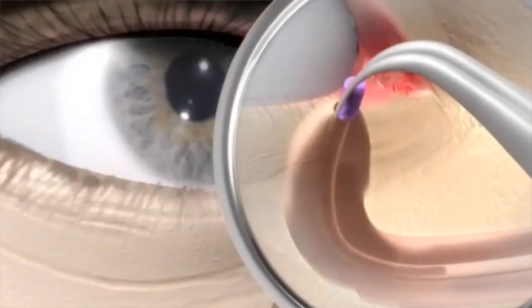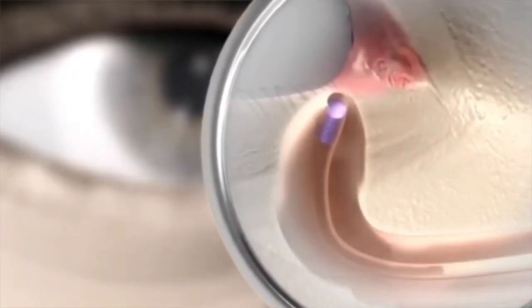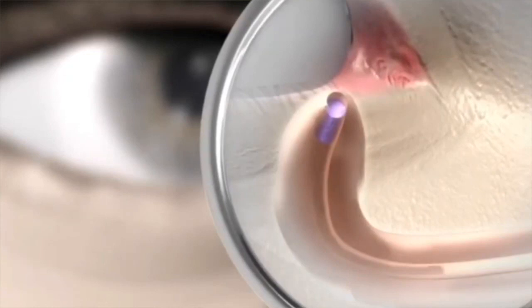In addition, during the surgery or after the surgery, we can place small tear drain blockers in the area where tears drain from the eye. They're called punctal plugs. By placing those there, they last about 3 months. They're temporary. They do help keep more of the body's own natural moisture on the eye surface, promoting the best comfort and clarity of the vision and health of the eyes for 3 months.